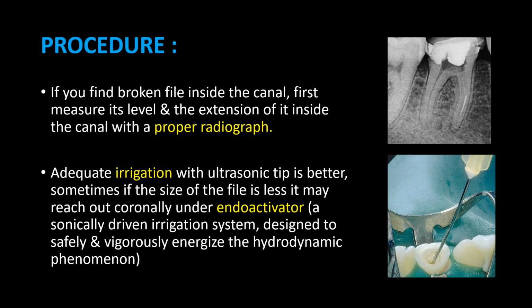Procedure: if you find a broken file inside the canal, first measure its level and the extension of it inside the canal with a proper radiograph. Adequate irrigation with an ultrasonic tip is better. Sometimes if the size of the file is small, it may reach.